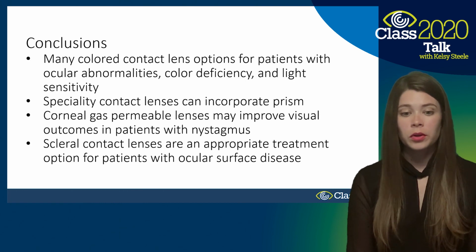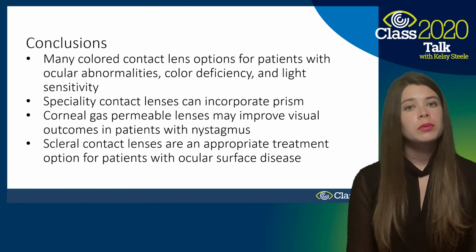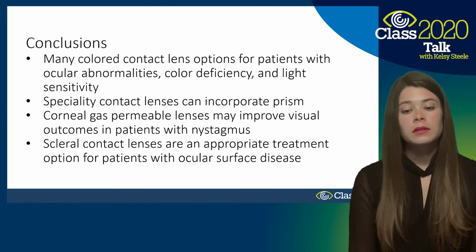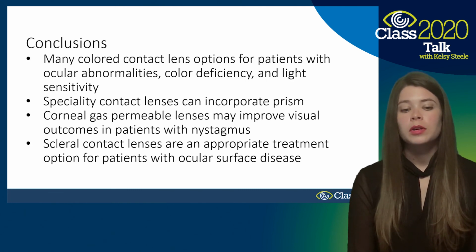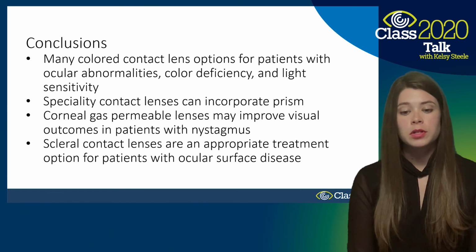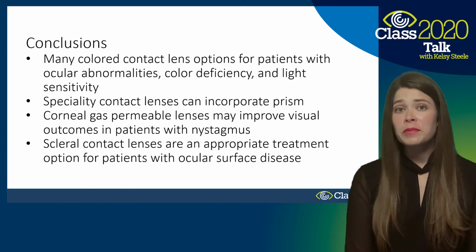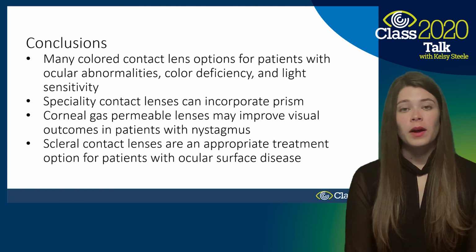And then, like I said, corneal gas permeable lenses may improve visual outcome and dampen the motor response in patients with nystagmus. And then finally, scleral contact lenses can be an appropriate treatment option for patients with dry eye and ocular surface disease.